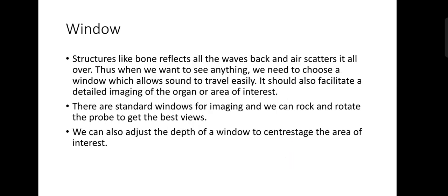Now we also need a place through which the ultrasound beams can pass through the skin. Structures like bone reflect all the waves back, so we can't see much, and air scatters it all over. So even if there is a speck of air, ultrasound becomes impossible. The biggest challenge is doing it in the presence of subcutaneous emphysema. And make sure that you apply the jelly very well and place the probe in such a way that there is no air pocket between the probe and the skin.